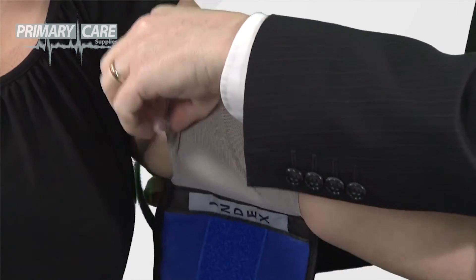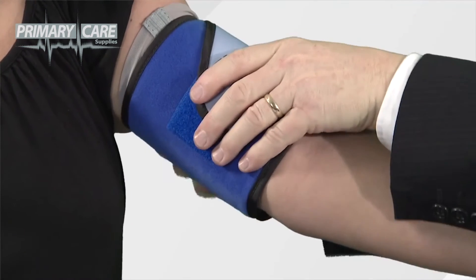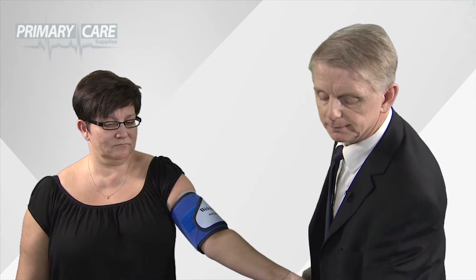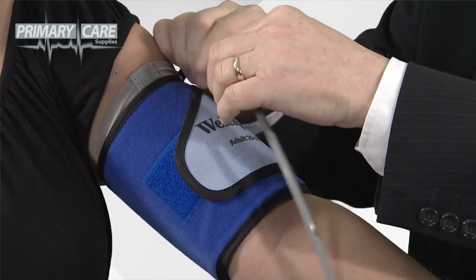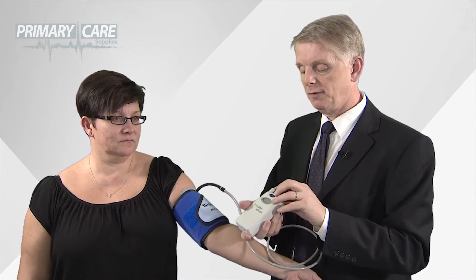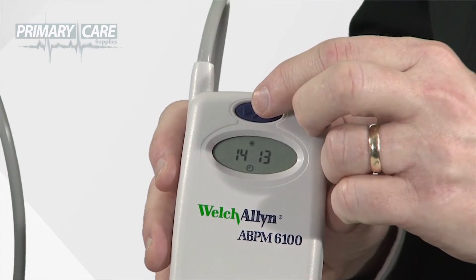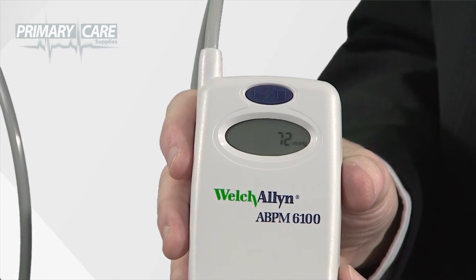When you're ready to fit the cuff, take the elasticated sleeve and slide it up the arm into position. Then wrap the cuff around the patient's arm until the Velcro fastens, with the cuff tubing pointing towards the top. Attach the ABPM unit tubing to the cuff tubing. To start the test, press the blue button on the front of the ABPM unit twice.